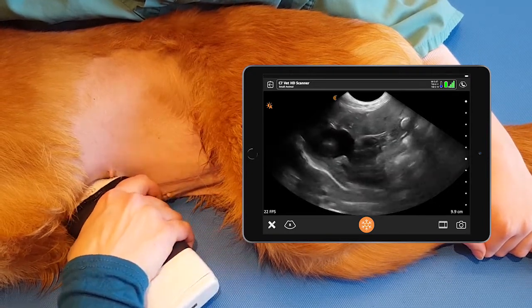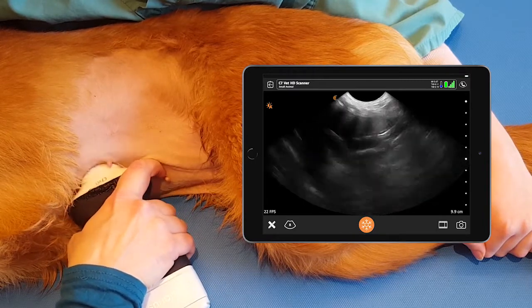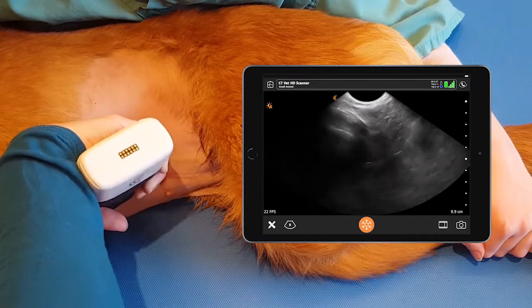Then we can see the caudal view by rocking the probe caudally and fanning all the way up and all the way down through the gallbladder.